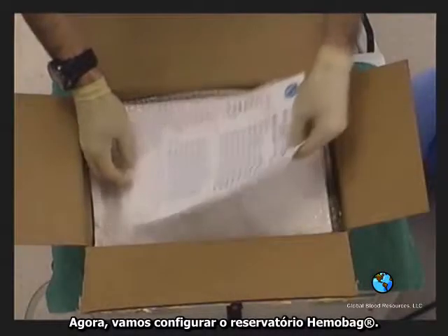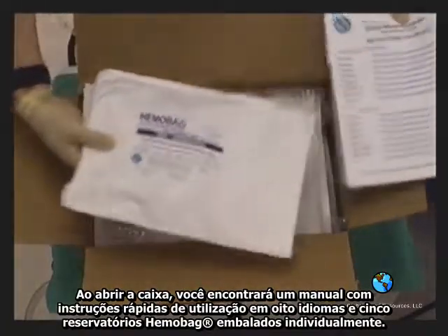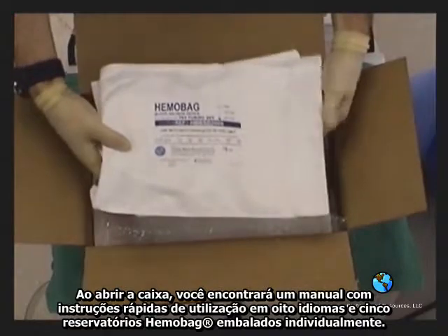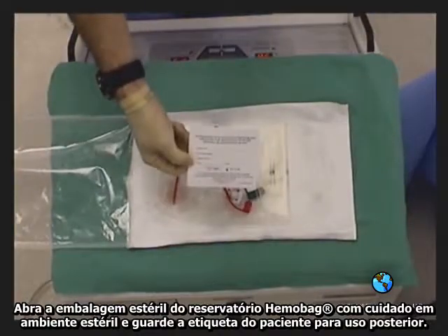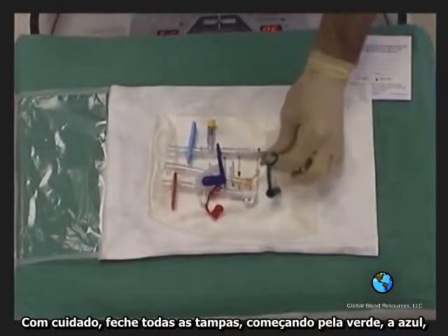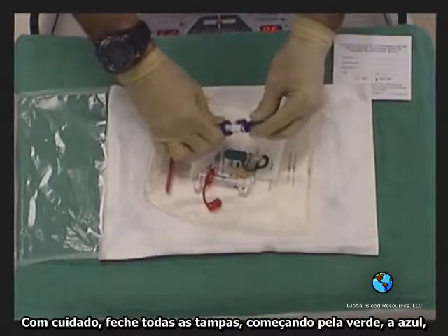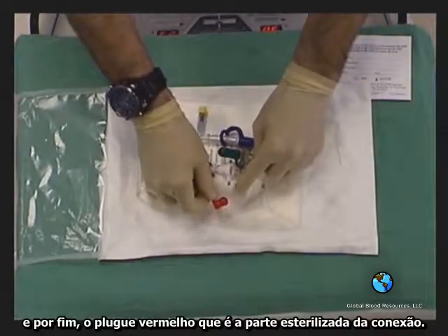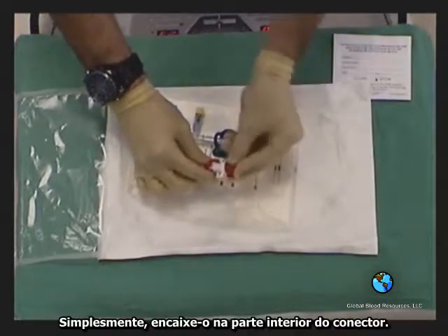Now let's set up the Hemobag. Opening the box, you will find the links page for the directions for use in 8 languages and 5 individually packaged Hemobags. Sterilely pull back and open the Hemobag peel pouch and save the patient label for later. Carefully close off all the ports, starting with the green cap and the blue cap, and finally the red plug, which is the sterile part of the connection. Just place it inside the quick connector.